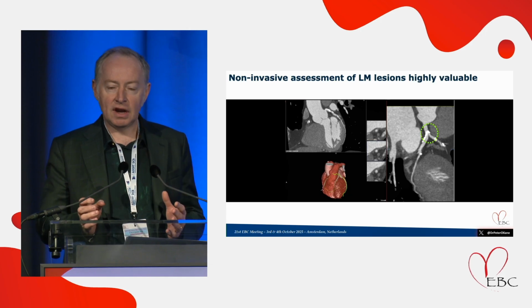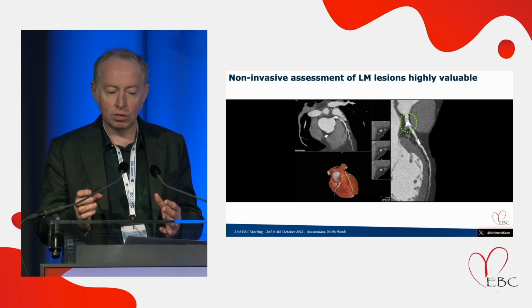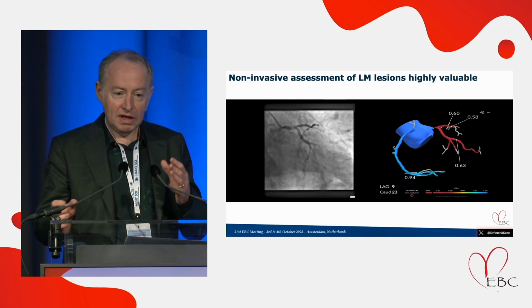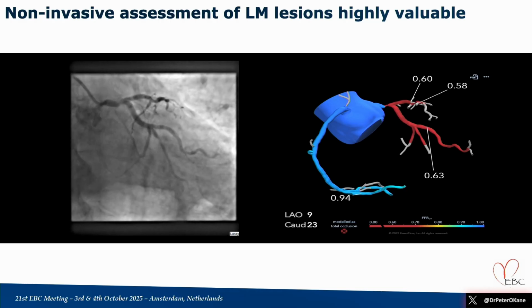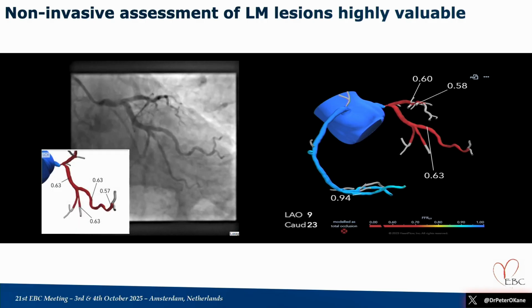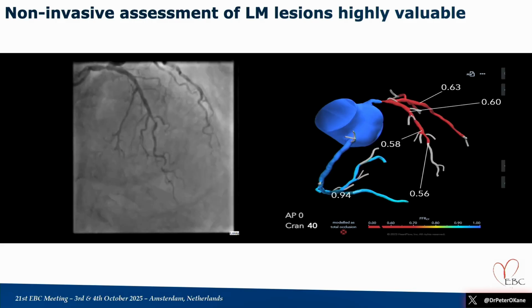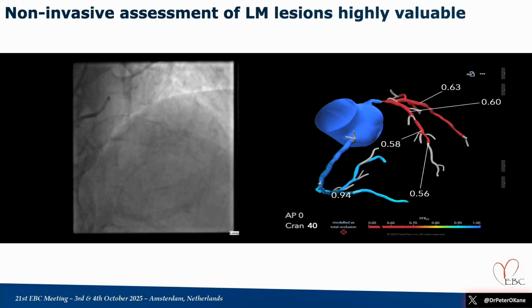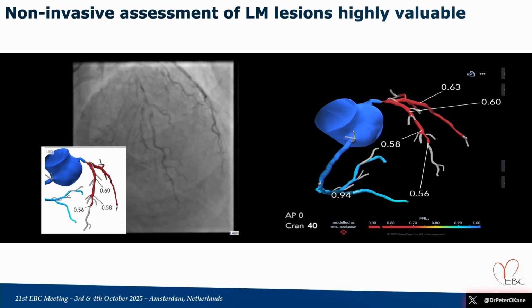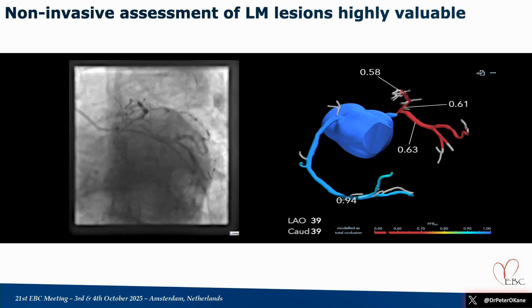And if we're going to treat it, then I think what we've seen earlier on today is how CT coronary angiography is such a great tool at recognizing the presence or absence of calcium. It's available, and we don't need fancy packages. We just need to sit down at our consoles and look at some of the images, because they're all there for us. It gives us a huge amount of information before we go anywhere near the case. We can work out whether it's focal disease, whether it's vessel specific. We can understand the morphology in more detail, and that will allow us to plan our strategy in terms of what tools we might need, and also perhaps what operators we pick.